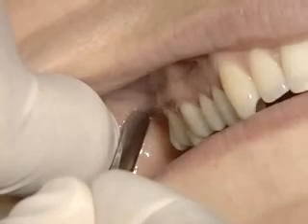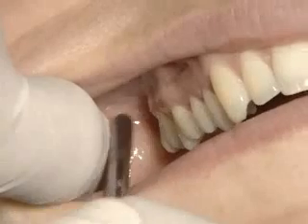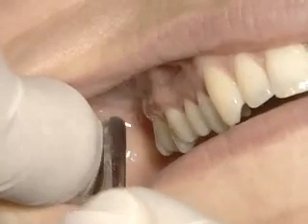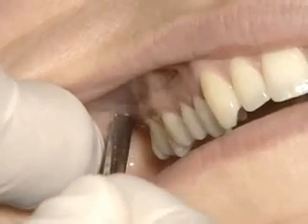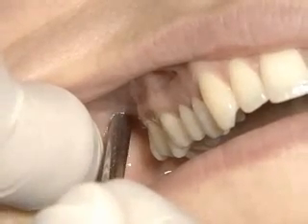And in a lateral to medial plane, the medial border is the maxillary tuberosity, the lateral border is the tendon of temporalis, and the final insertion point is right in between the two here. So this represents the final insertion point for the Akinosi closed-mouth technique.